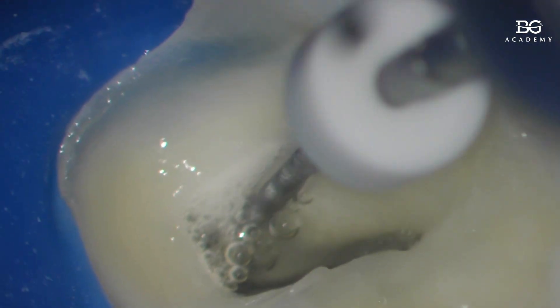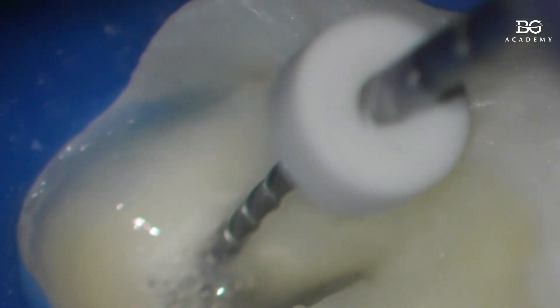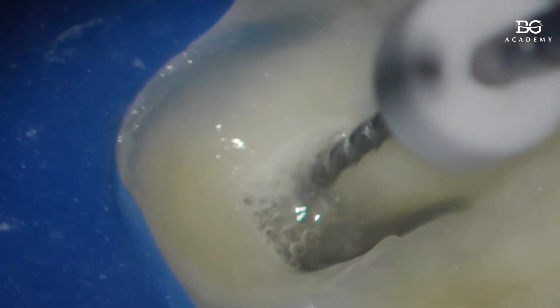We turn it in the constant mirror so we can see the stopper — we have a reference area, that little bump. And now we've gone in. I've already gone in to 17 millimeters. I'm not going to push it any deeper right now. What I'm doing is leaving the file in the canal and working along the mesial wall — right now I'm widening the canal using the brushing technique.